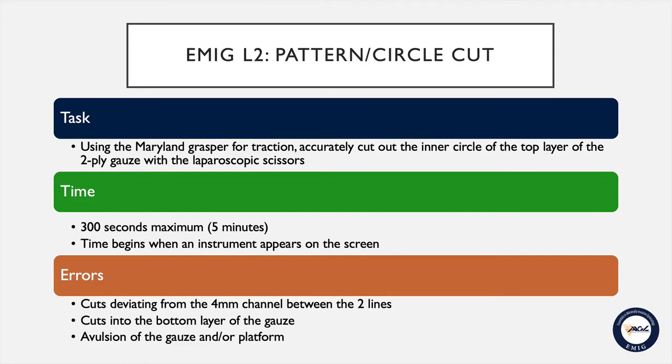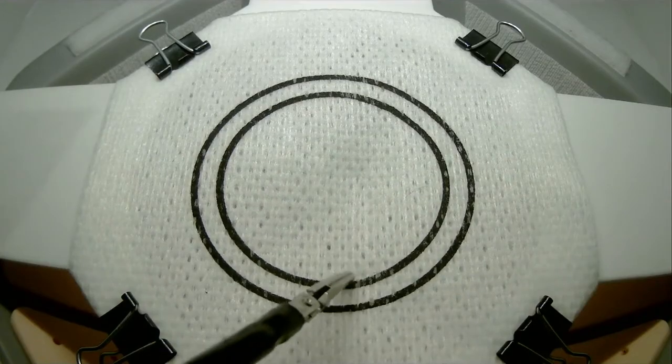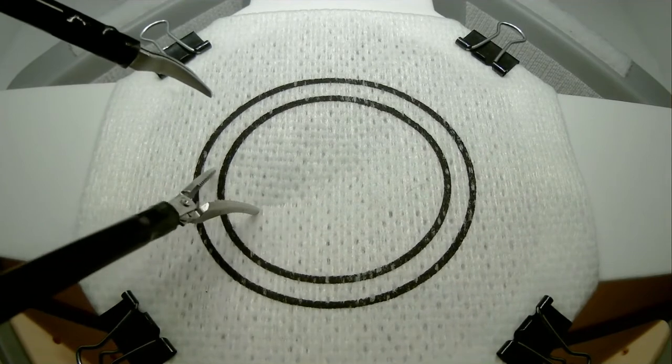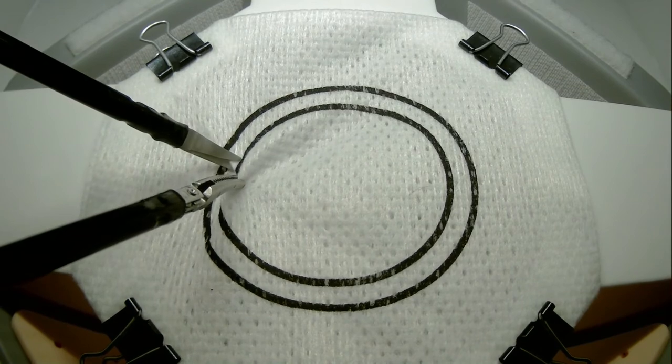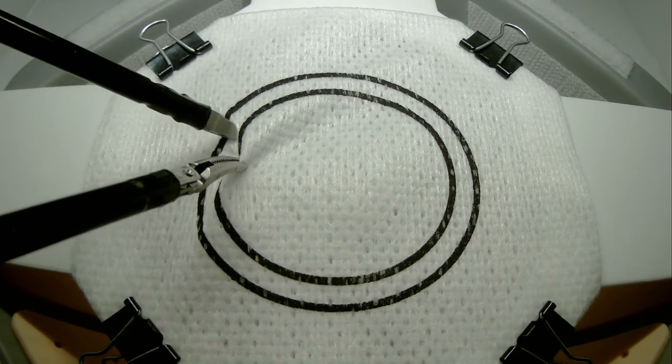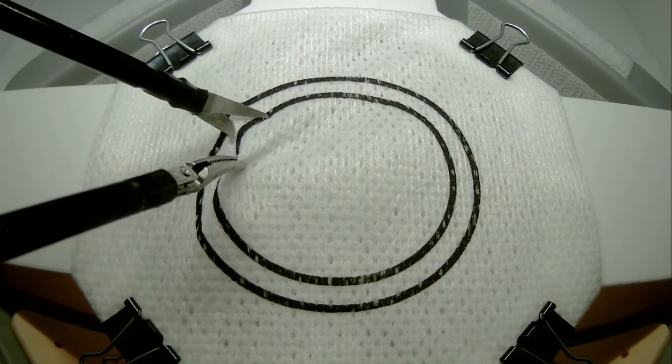Time begins when an instrument is visible on screen. You will use the Maryland grasper to tent the gauze so that you can perform the cut in between the inner and outer circles of the gauze.